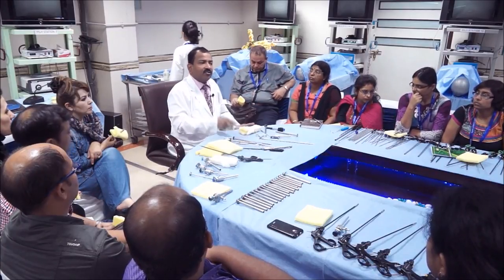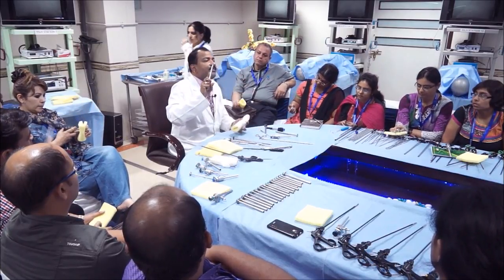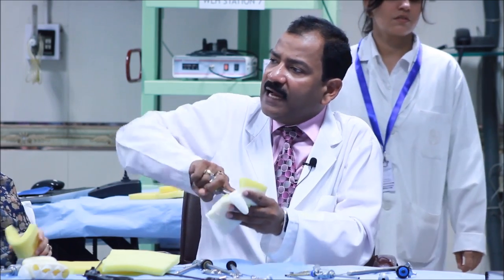So always the trocar should go perpendicular, and guarded by the index finger. And you should never push the trocar. Let it go by its own, by rotating movement. Keep on rotating, and take your time. And it is easy and smooth.